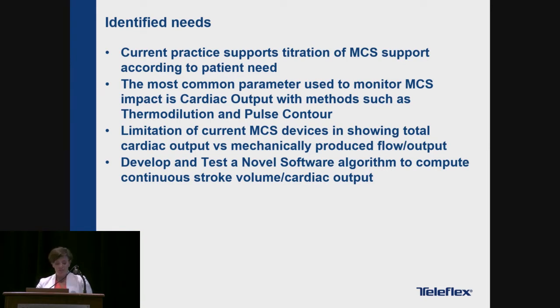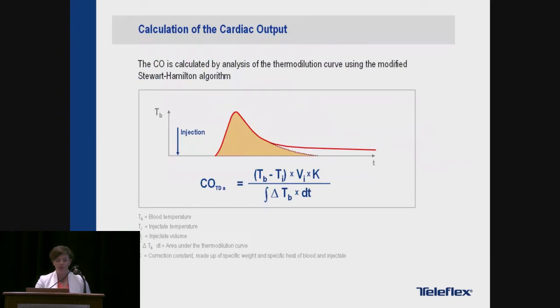Now, certain balloon pump systems currently calculate aortic flow, which is based on stroke volume from a high-fidelity arterial pressure signal. Information from the flow is used in the time domain to set inflation timing on an intra-beat basis. However, if flow can be calibrated for volume, it would indicate the stroke volume on a beat-to-beat basis. Working again with several leading scientists and physicians, we developed a method to calibrate the flow wave for volume and confirmed that even in the presence of the balloon pump, it can calculate stroke volume from the native left ventricle, providing a measure of hemodynamic impact from the balloon pump.